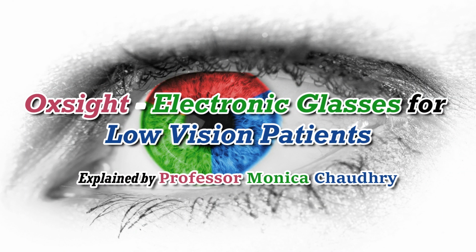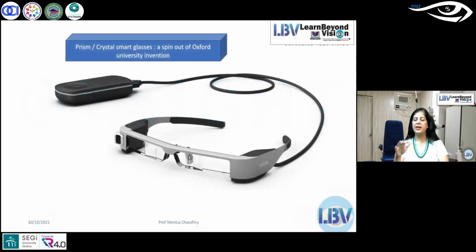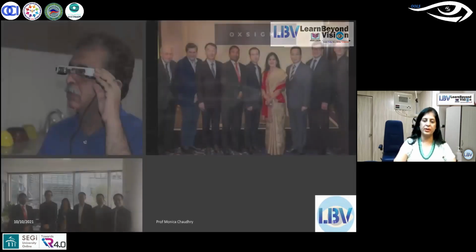I'm going to show you some devices which were developed by Oxsight. Oxsight stands for a spin out from Oxford University, UK, and they have developed many electronic glasses as an innovation. And this is the picture of it. In fact, this is the old picture. They have revised the version of it to a further one, which I don't have access to.